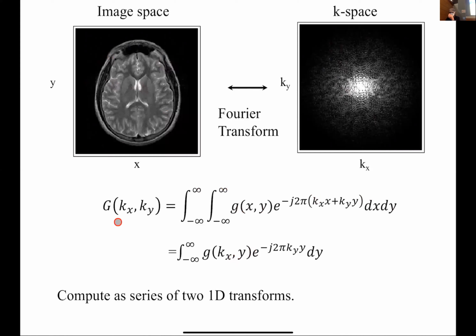That's a very useful way, and obviously in your homeworks you use FFT2 and you don't really have to think about it. But thinking about it this way is useful, though it's limited to Fourier transforms. Everything we've done up to now is Fourier transforms. But where the world is going is really what's called beyond Fourier. Fourier imaging has been super useful, but with the advent of computers, now the world is going beyond Fourier.